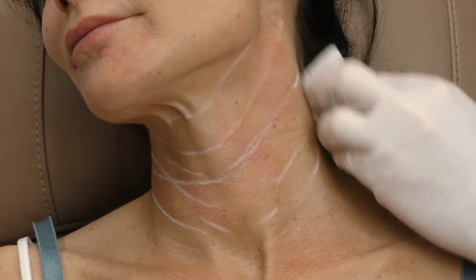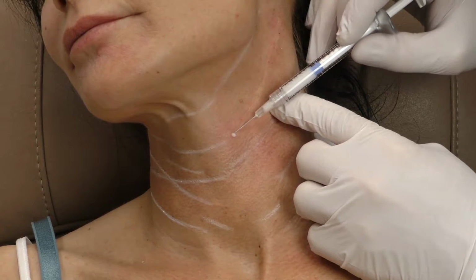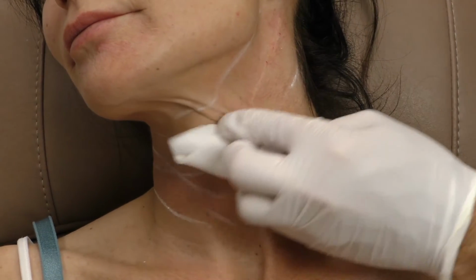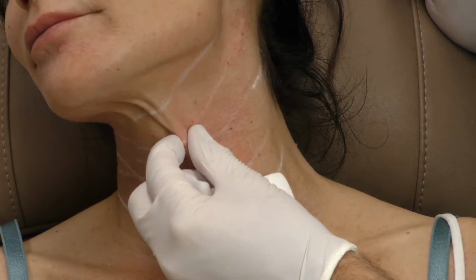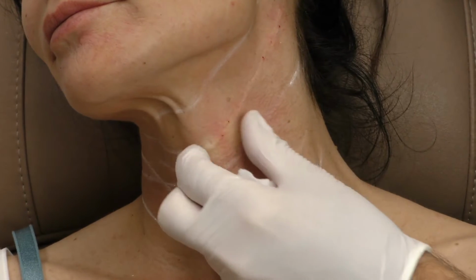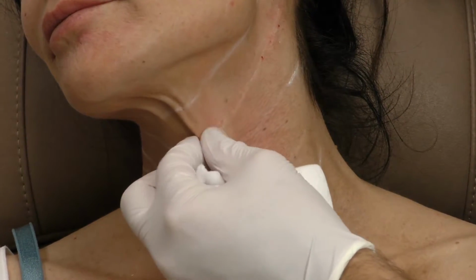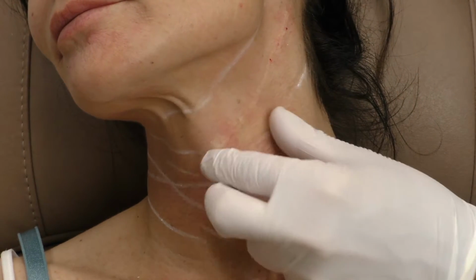Of course, you can also use a cannula. It's a little bit faster to use a needle. Usually bruises a little bit more. Now you see there's a little bit of a visible deposition, so I am immediately taking that with my fingers and rolling the skin between my fingers in order to even out the diluted calcium hydroxyapatite.